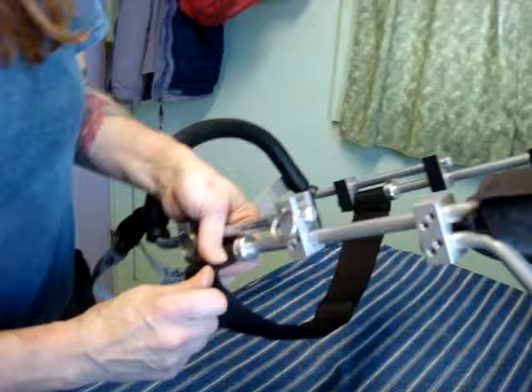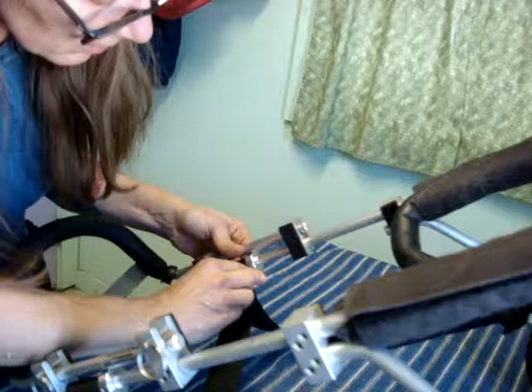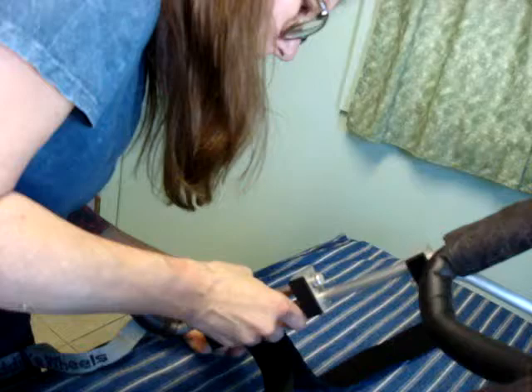So would you show how the velcro undoes? Yeah. So when you put the dog in the cart the first time, undo all the velcro. Take the lock off so you can undo it all. That's what that little double-sided piece of velcro is for — to lock it on.